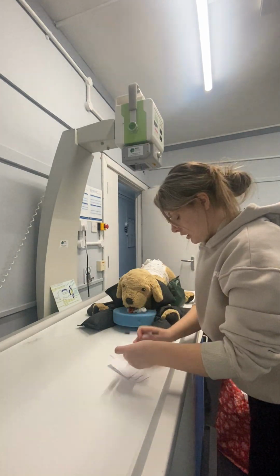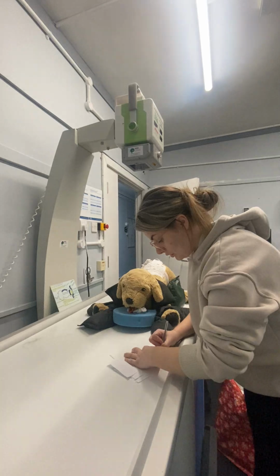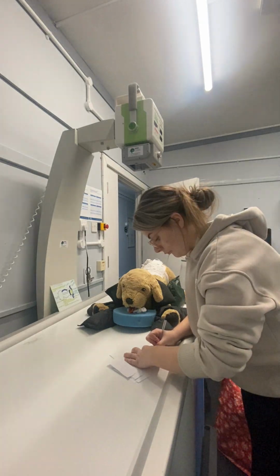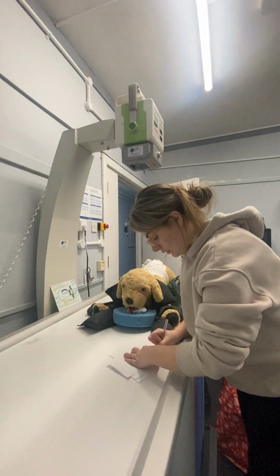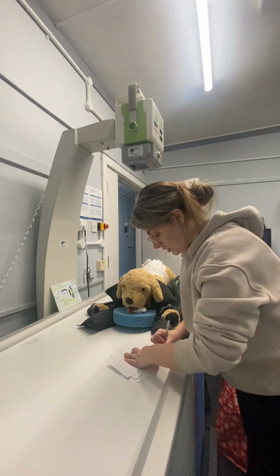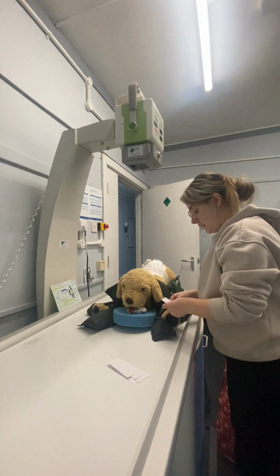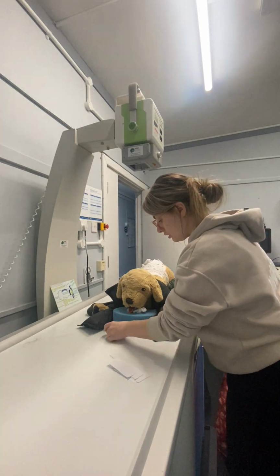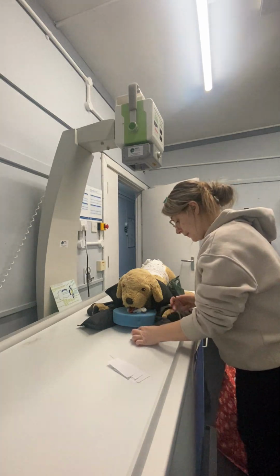I'm just going to make the patient's label up. So it's going to have the patient's name, the date, and the patient ID. And that's just going to go into the collimation as well, where I can get it in.